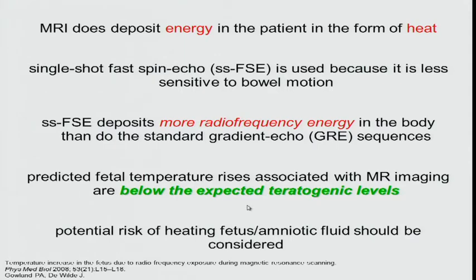But the energy deposition is below the expected teratogenic level for the fetus. So that's something if your colleague needs to talk to a mother about this. There was some concern early on, probably about 10 years ago, we weren't sure if the strong magnetic fields that you applied to a first trimester fetus would affect migration.